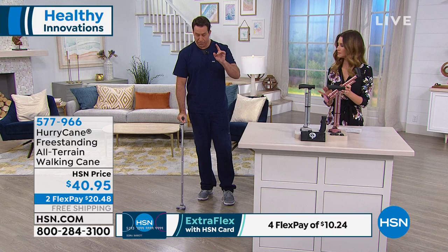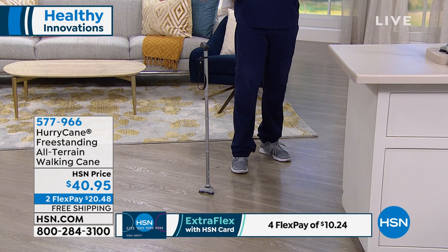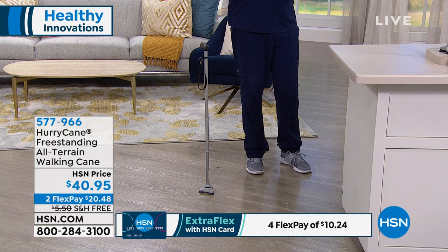Up to 350 pounds of weight. We'll talk about the pivoting base — it's freestanding. So when I stand it on its own, I can reach up, grab something off the store shelf, shake hands with a friend.